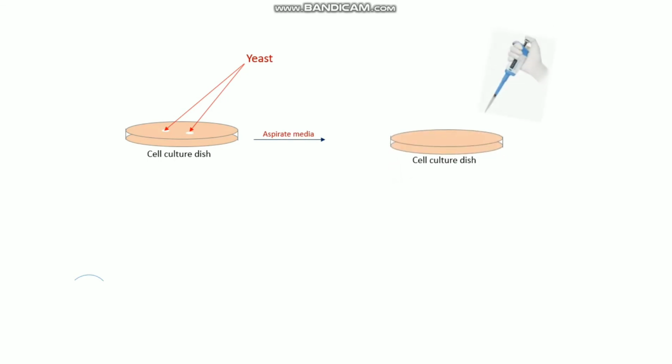What you have to do first, if you have the contaminated cells, is aspirate the media and replace it with fresh media, but very carefully. If you use this kind of media, don't use the same media or PBS for other cell cultures. Use fresh complete media, and at the same time add amphotericin B, 0.25 to 2.5 microgram per ml, directly into the cell culture dish.